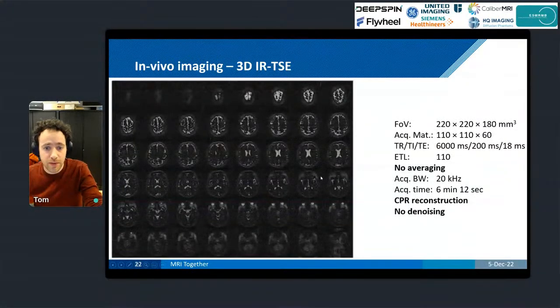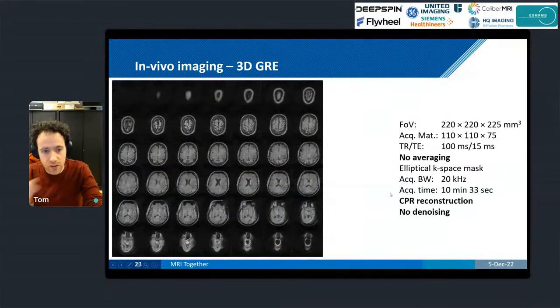For CSF, if you want to only look at the CSF, and this is something that's relevant for the research collaboration that we have with the people in Uganda who are looking at hydrocephalus, you can run these CSF only scans, and you very much see where the fluid buildup is in the brain. So again, for a 50 millitesla system that costs about $20,000, $30,000, it's not bad. And despite the large B0 inhomogeneity, we're still able to acquire gradient echo images for most of the brain. We only start getting a little bit of loss towards the bottom of the brain near the cerebellum.